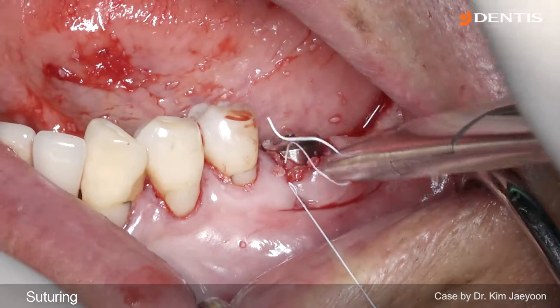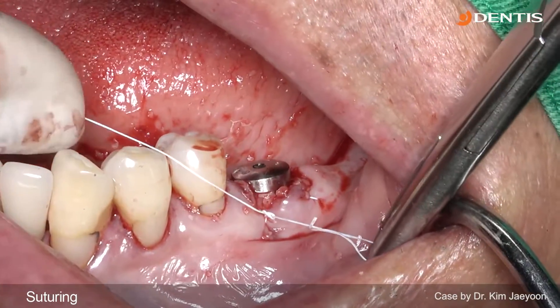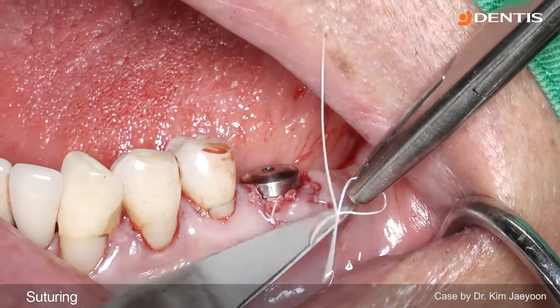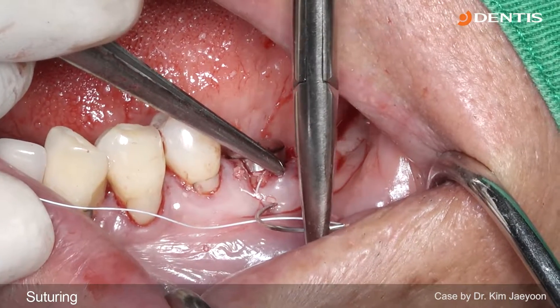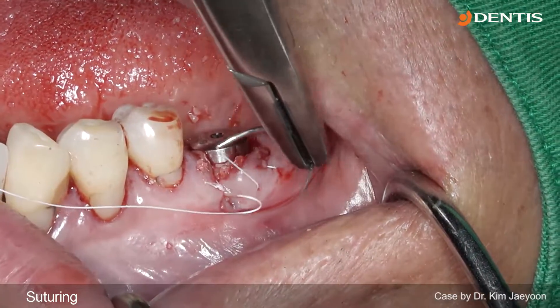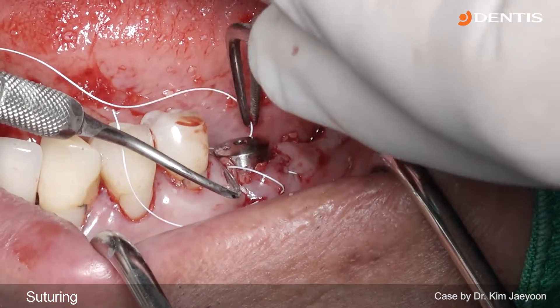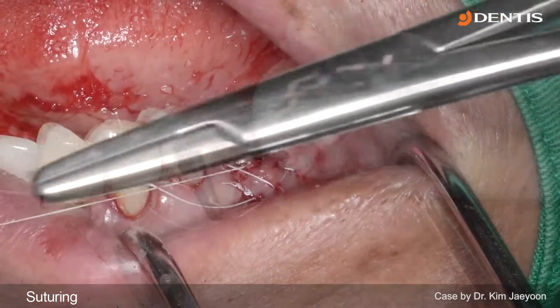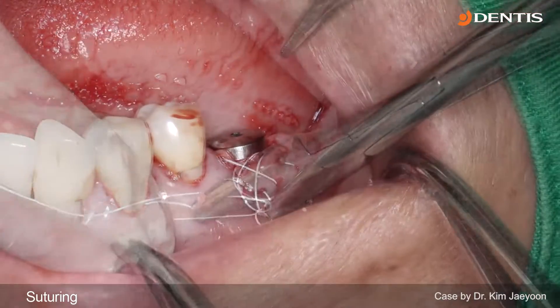After using the figure-of-8 to close the flap, there is a slight gap between the buccal flap and the healing abutment. So I use an additional anchor suture to adapt the flap more closely to the healing abutment.